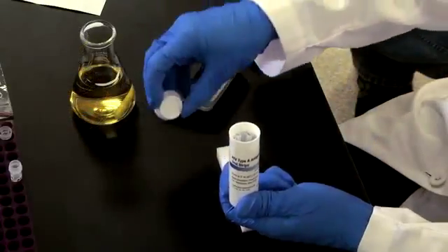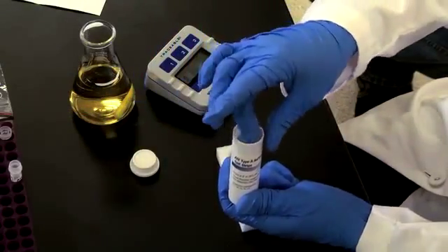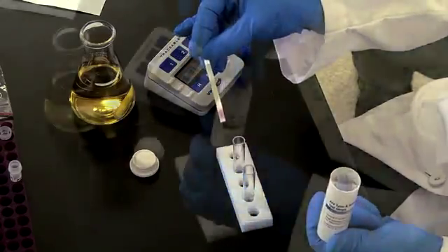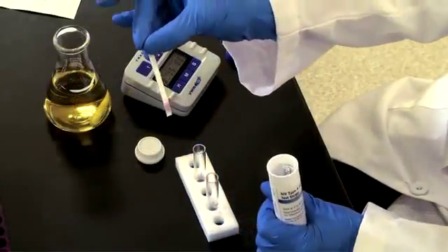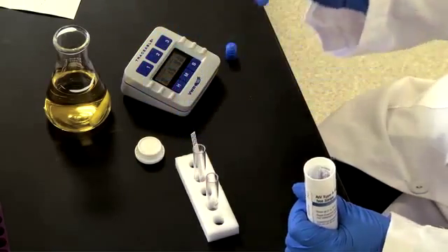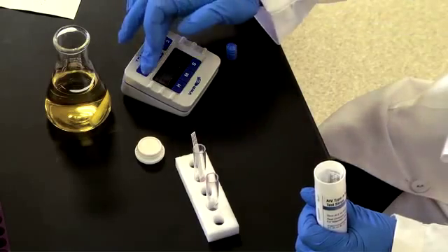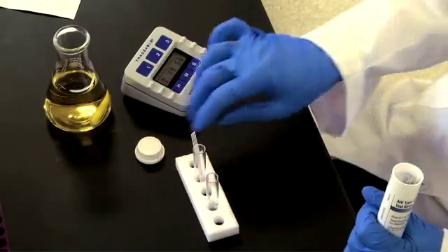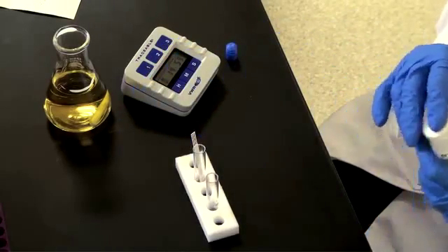Then, remove a test strip from the desiccant vial for each sample to be tested. Handle the strip on the labeled portion only. Place the test strips directly into the test tube containing the sample. Position the test strip so that the pink pad is submerged in the extracted sample. Allow the strip to incubate in the sample for 15 minutes. Remove the test strip from the test tube to read results.